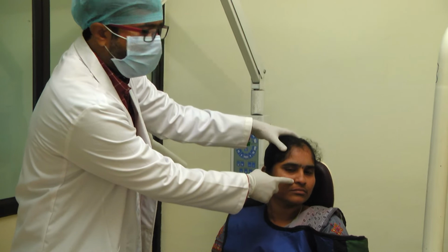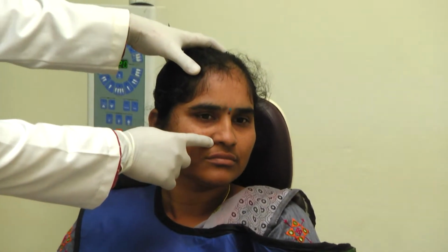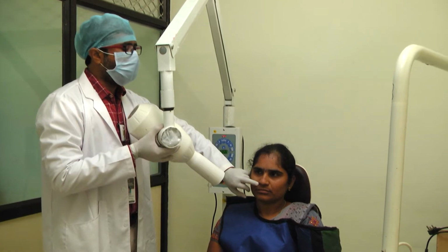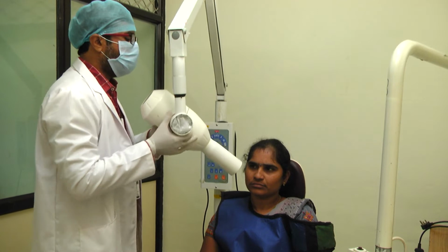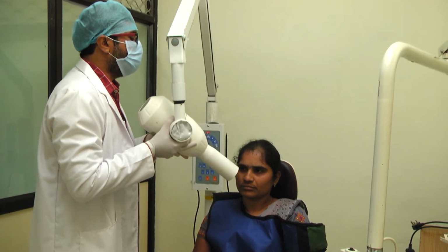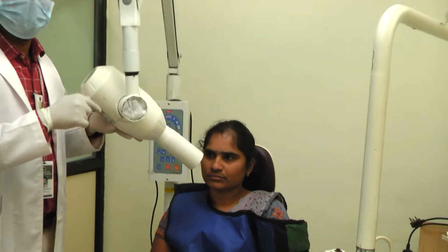Now the point of entry of the central X-ray beam: if you look at the ala of the patient's nose, the intersection of the distal and the inferior border of the ala of the nose should coincide with the central X-ray beam. So for maxillary canine, always consider the distal and the inferior border of the ala of the nose. Adjust the vertical angulation to plus 45, and the point of entry is the intersection point of the distal and the inferior border of the ala of the nose. So this is exactly the point of entry for the maxillary canine.